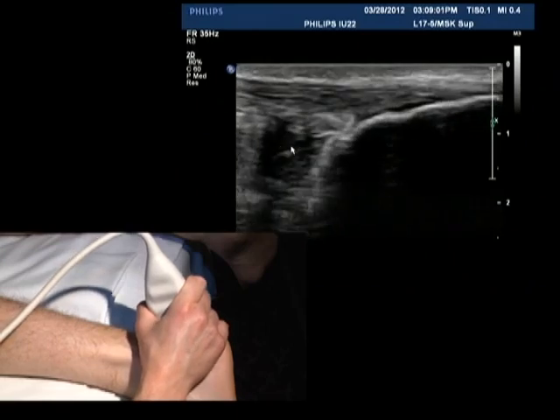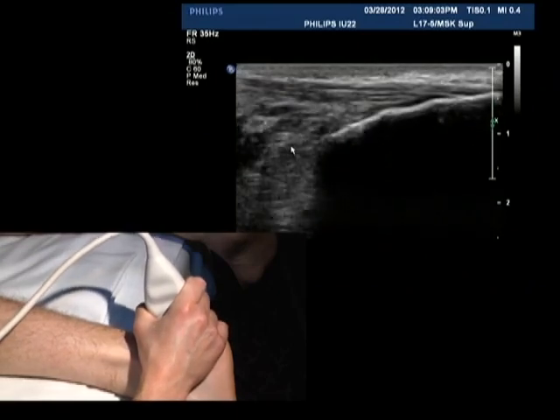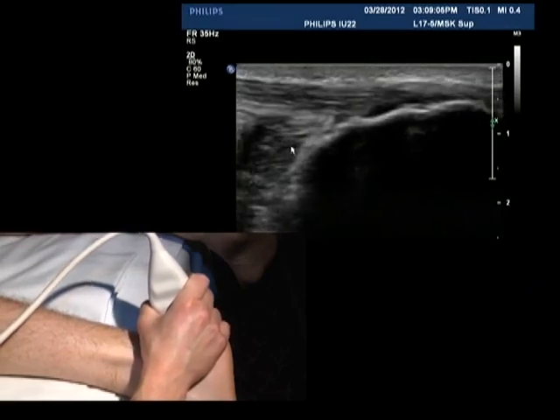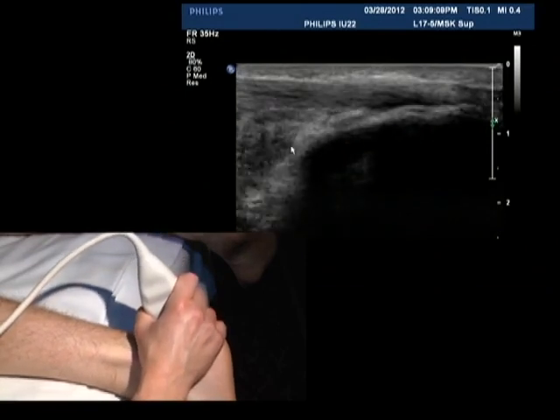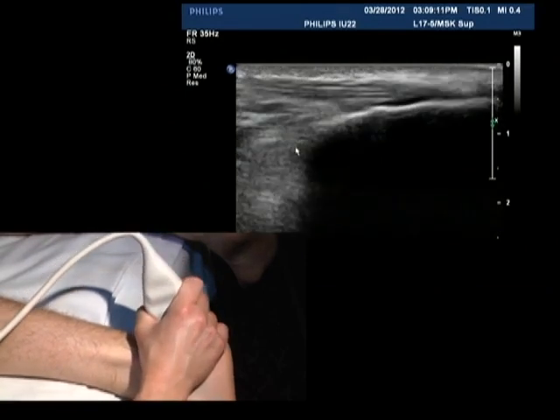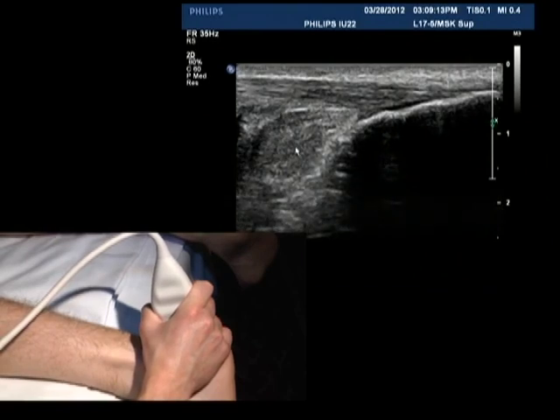Nice fibrillar pattern, long axis. But again, remember in this area right at the insertion to make sure that there are no areas of hypoechogenicity and just kind of heel it in, so just straighten it out. If not, you'll start getting anisotropy there. So you want to heel it in to make sure that you can see it.